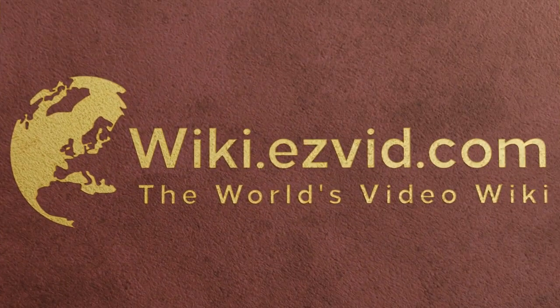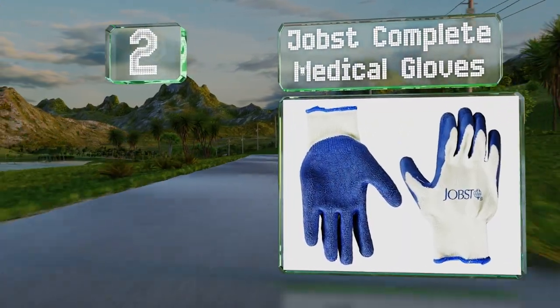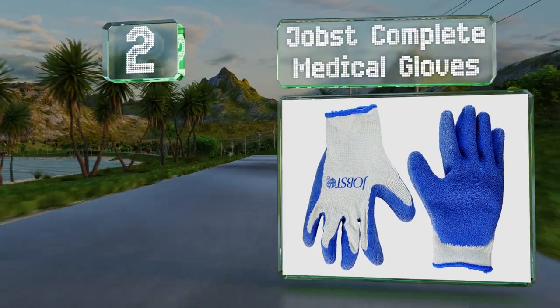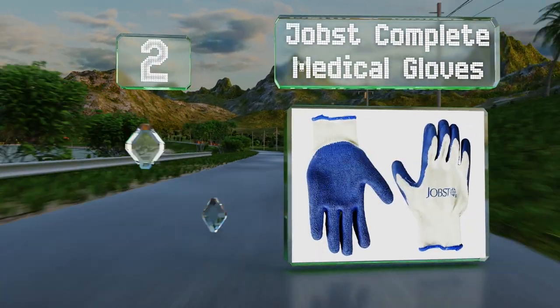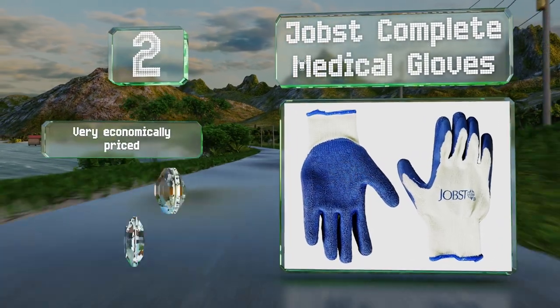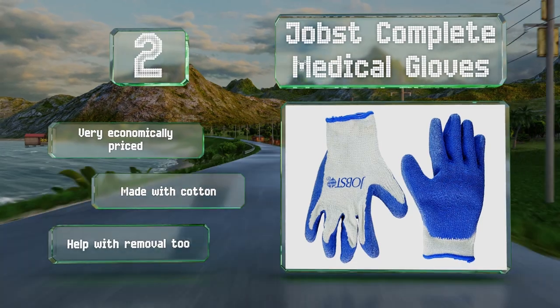At number 2, about as simple a solution as you can get: the Jobst Complete Medical Gloves have a blue latex coating to provide a good grip. They come in two sizes, small and medium. These are very economically priced and are made with cotton. They help with removal too.